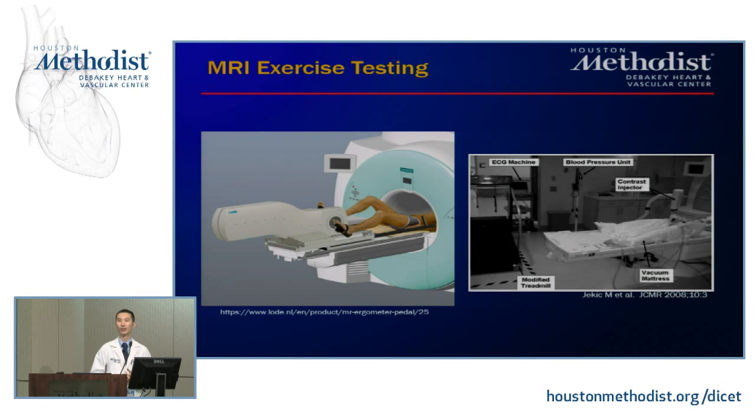Kind of a little involved, so not exactly being adopted readily by most institutions, but just so you're aware, it's out there. We also have recumbent bike, and believe it or not, at one point our heart failure group was looking at this with us. There was the idea of doing dynamic cardiac assessment on patients at different bike workloads. I believe this is still being talked about a bit, but I haven't heard much in terms of bringing a bike to Methodist yet.